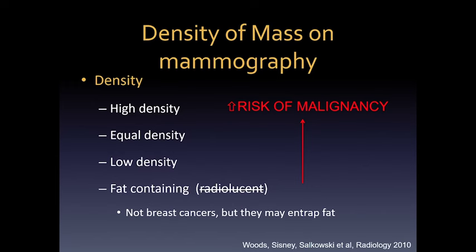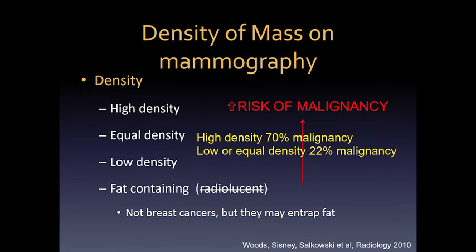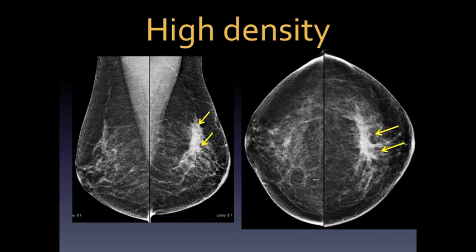The next feature of a mass to look for is density. The most worrisome feature is high density — that is, more white, possibly the most dense part of the breast on the mammogram. As you go down in risk: isodense or equal density, then low density. Fat-containing lesions are typically not associated with malignancy, but be careful because some breast cancers may entrap fat. A study by Woods et al. in Radiology showed that lesions with high density had a 70% risk of malignancy, whereas those of low or equal density had a much lower risk of 22%.